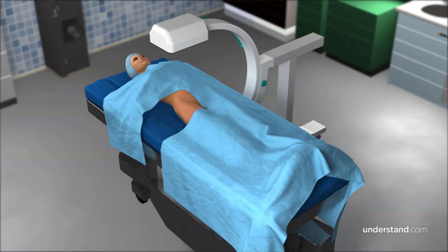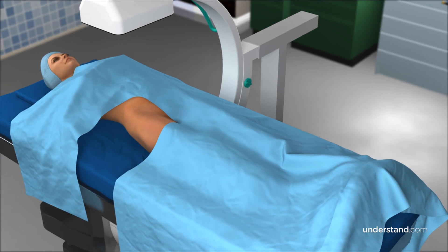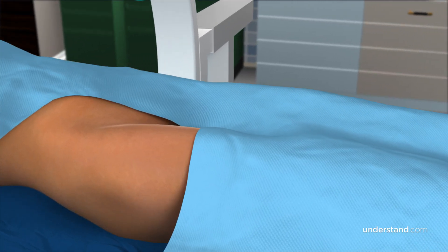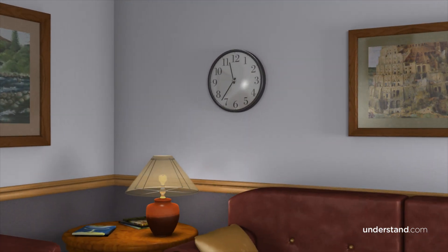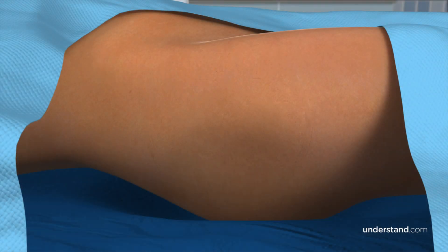There are a few variations for the incision for the PAO procedure, which differ in how the pelvic bones are accessed and cut in order to reorient the acetabulum. This animation will discuss the procedure in which a single incision provides direct access to the hip and pelvis. The length of the PAO procedure varies with specific patient anatomy and needs, but typically requires 2½ to 3½ hours. An incision approximately 4 to 6 inches in length will be made along the crest of your hip.